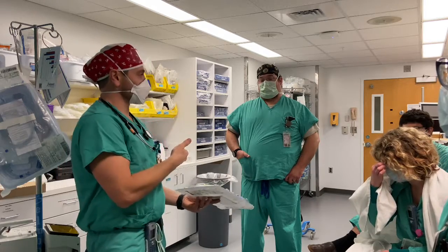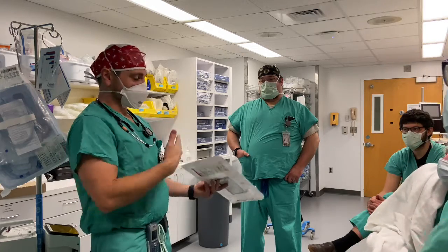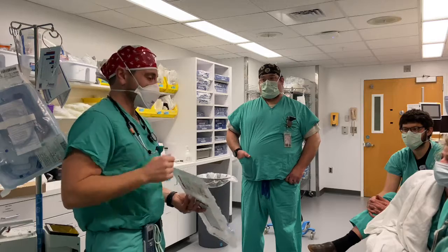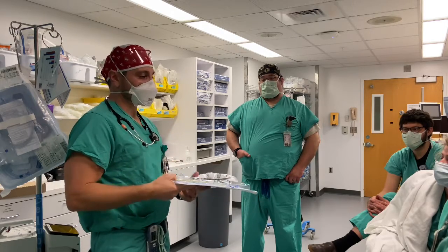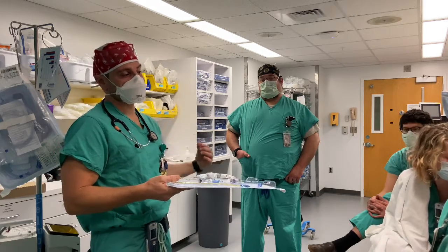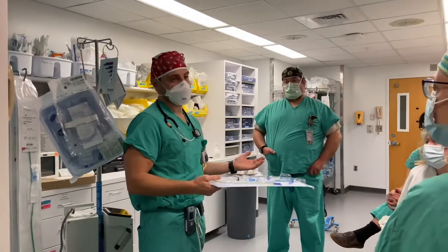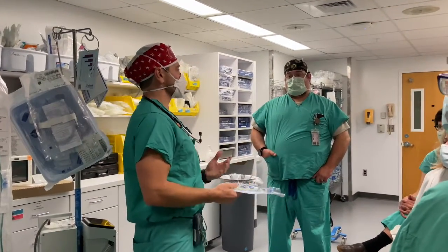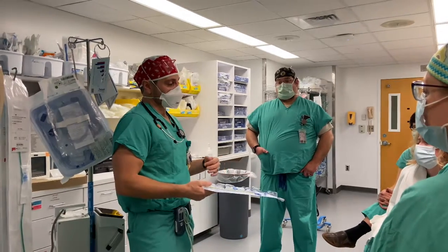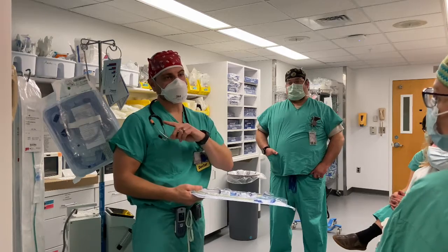So after a heart case, let's say we're doing a thoracoabdominal aneurysm, big chest case, multiple hours, lots of fluid shifts, lots of swelling of tissues. A lot of people get nervous about using a double lumen tube in those cases, even though they might need lung isolation, because at the end of the case, we don't want to send that patient up to the ICU with a double lumen tube because they don't use them up there, so they're not familiar with them, and that sets us up for mistakes being made. And so at the end of those types of cases, if you had been using a double lumen tube, you'd want to switch to a single lumen tube before you send them up to the ICU.